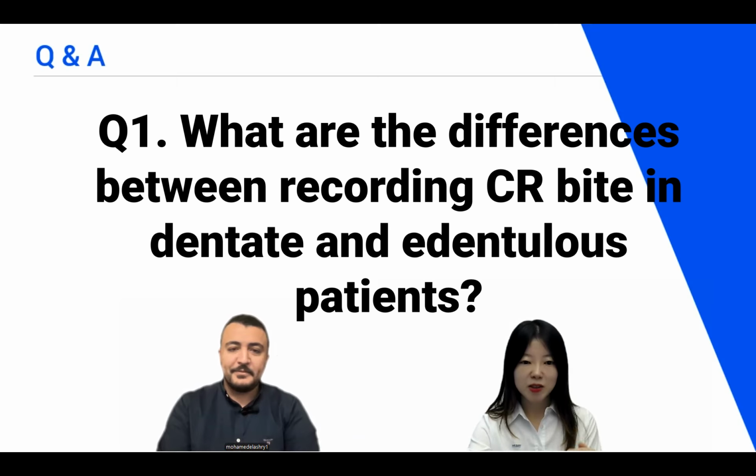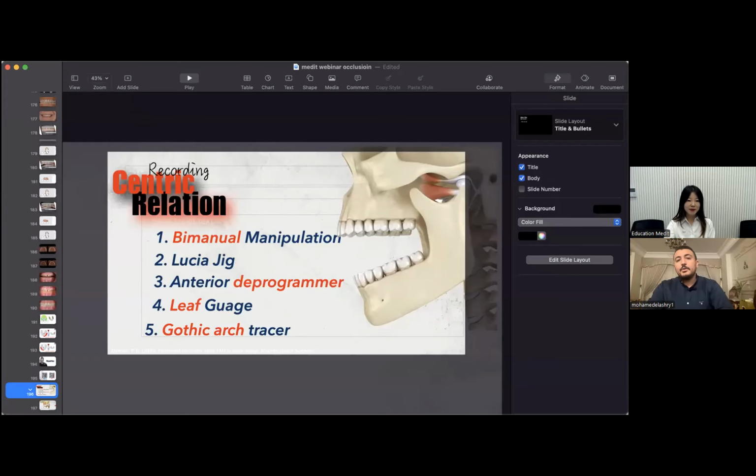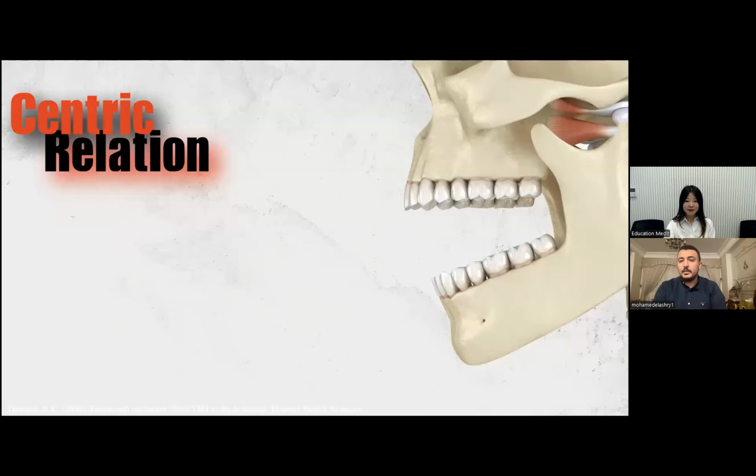There are some ways to do the CR bite recording. So what's your favorite way in an edentulous case? Actually, I want to share with you some slides. Oh, okay. Actually, you have many techniques to record the centric relation.